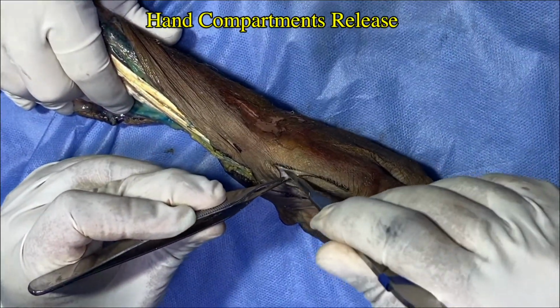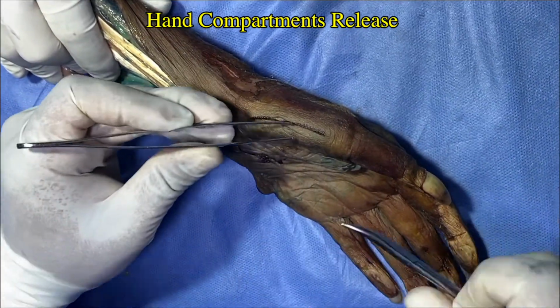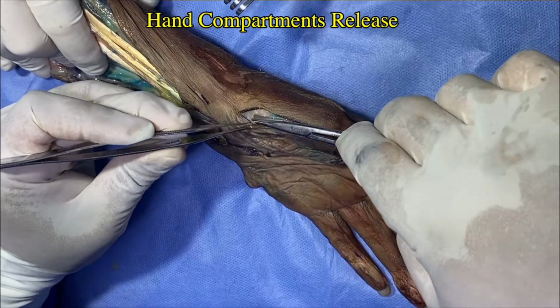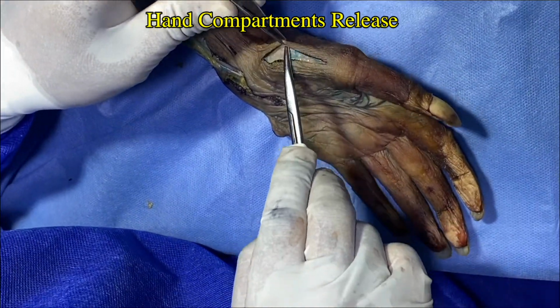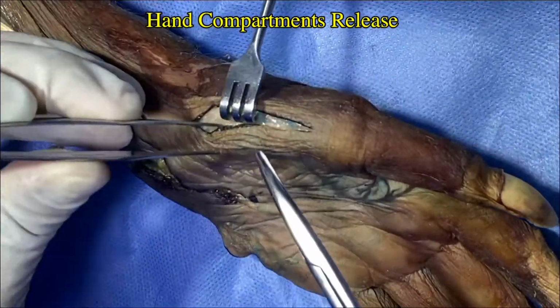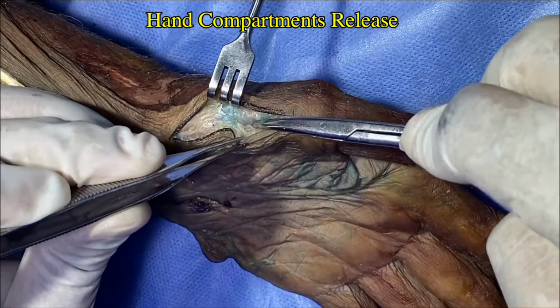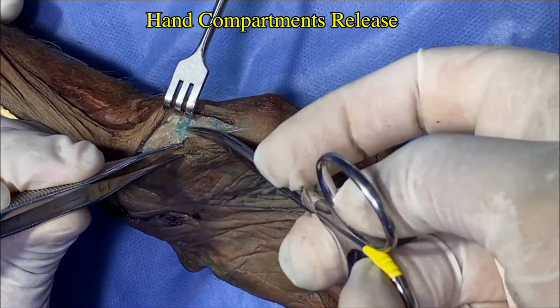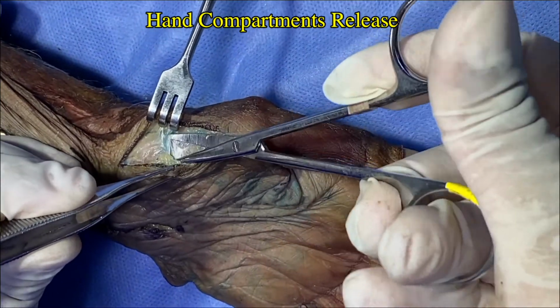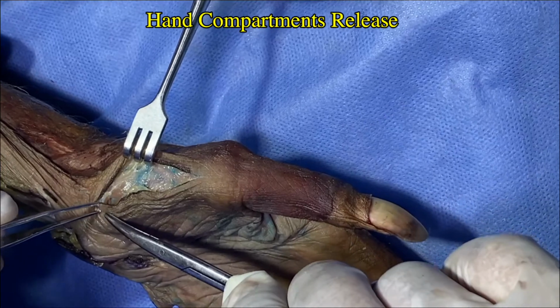To free the thenar musculature, we perform a longitudinal incision over the palmar and dorsal interface, immediately below the fascia of the compartment. We must perform dissection perpendicular to the approach with scissors to preserve the perforating vessels. Once a good exposure is achieved, fasciotomy and partial fasciectomy should be performed to free the compartment.